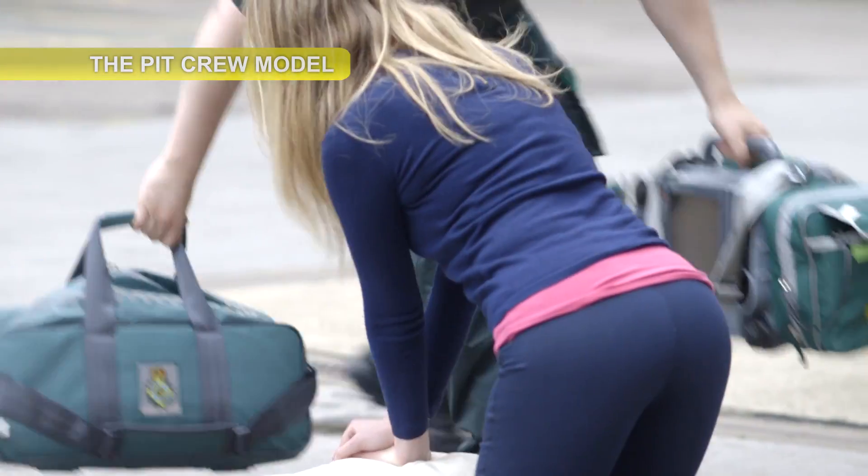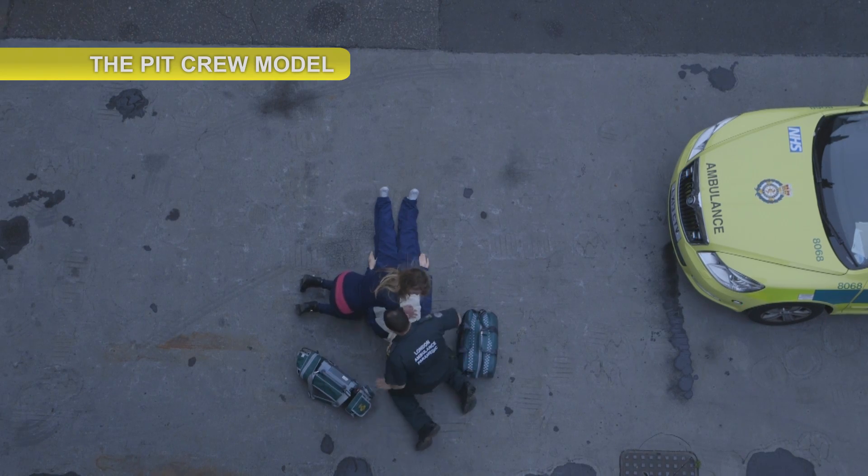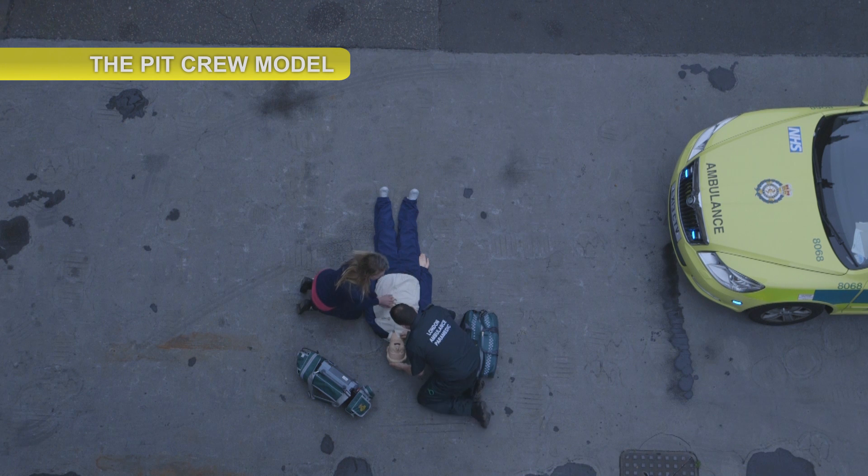My name's Nick. I'm a paramedic for the ambulance service. What's your name? My name's Catherine. Catherine, what's happened? I found him collapsed on the floor. Found him collapsed. Can you just stop for a second so I can check, please?